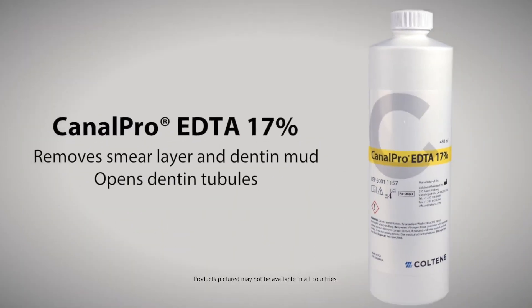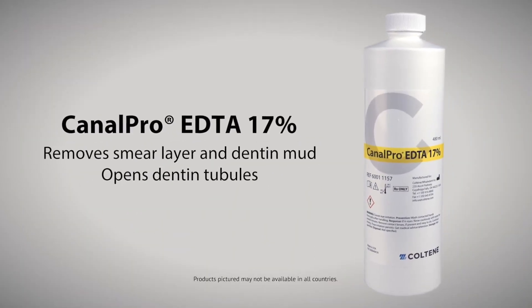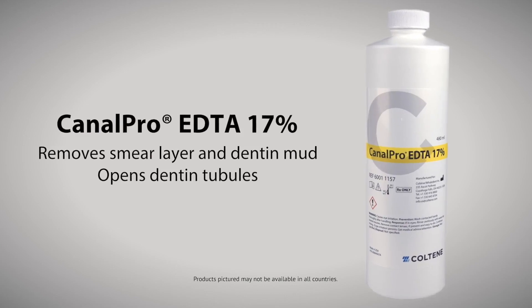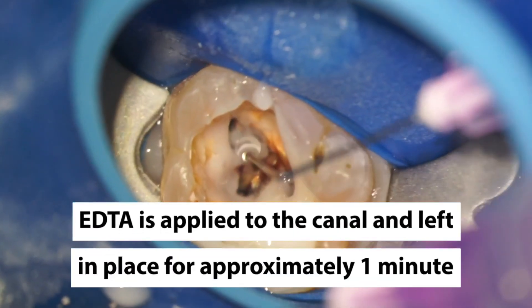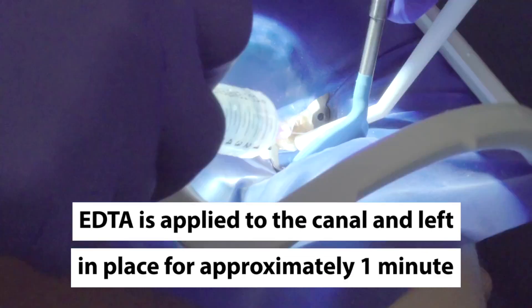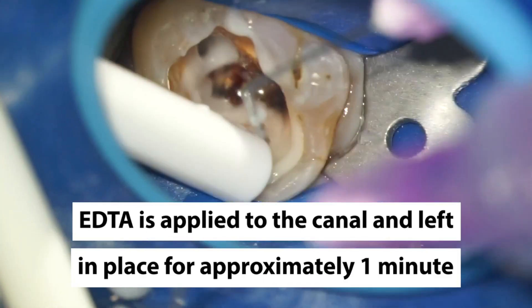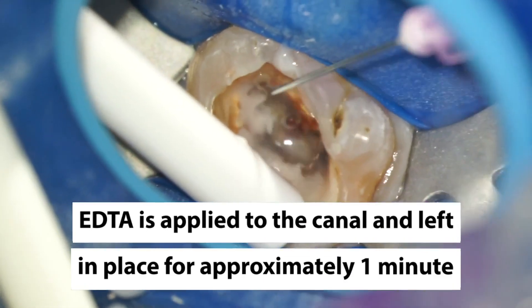One of the best ways to remove the smear layer from the canal walls is using a solution called EDTA. The EDTA is applied to the canal and left in place for approximately one minute, and helps in removal of the smear layer.